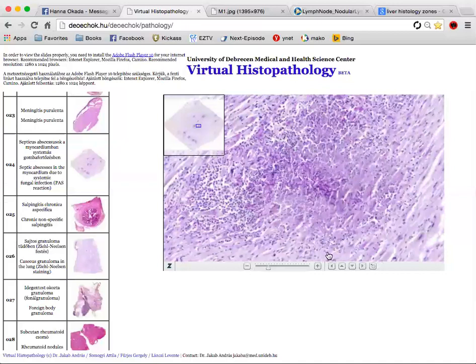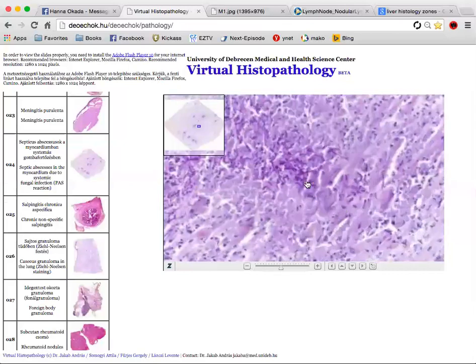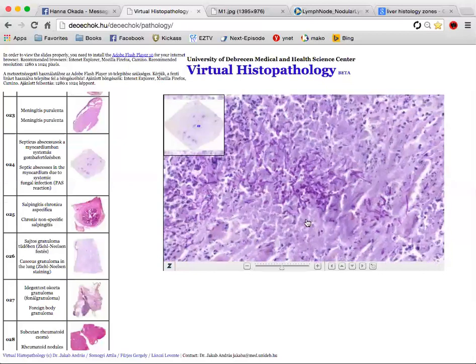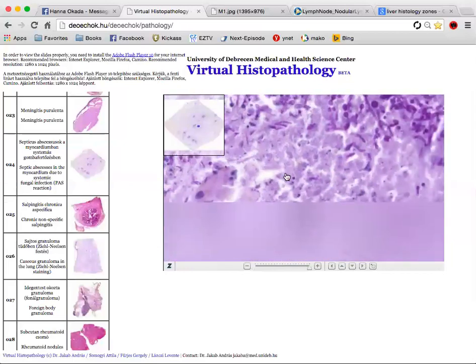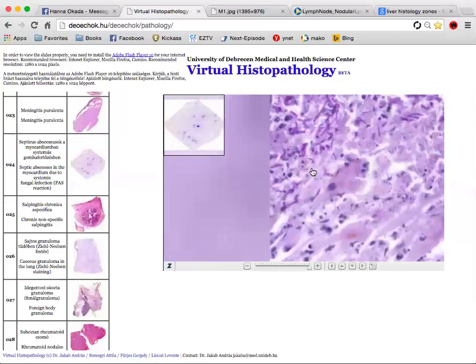So you're going to have immune cells on the outside, and then this cellular debris and the Candida here in the middle. And there is a sort of liquefaction going on here. This is all liquid. So I'm going to go from the outside in.